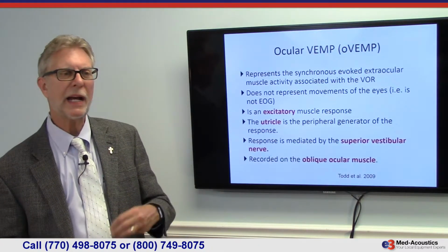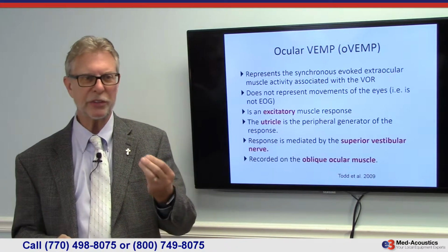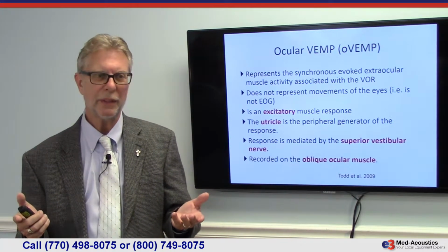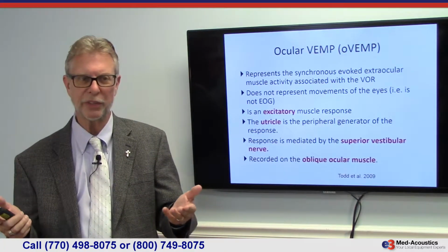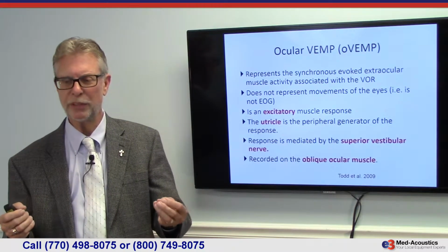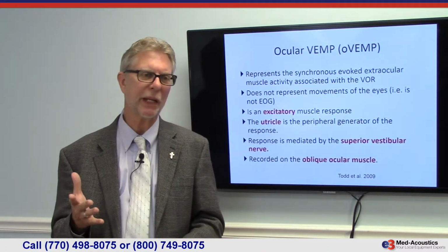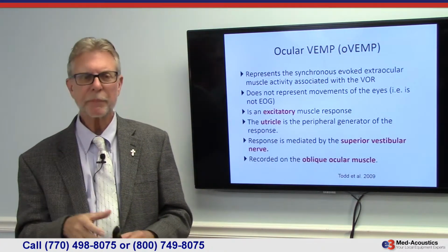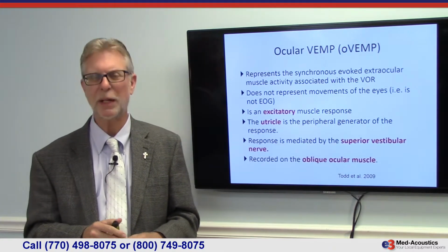Okay, so that's the cervical VEMP, the C-VEMP. Again, once you get used to doing this, it's very easy to do. You're talking about only 100 stimuli, so it's something that you could acquire within just a few seconds on right and left. So people who do it end up liking it because it's a quick and easy test. It could be contraindicated on some patients with conductive hearing loss, of course. That's preventing you from punching the saccule hard enough to get a response.